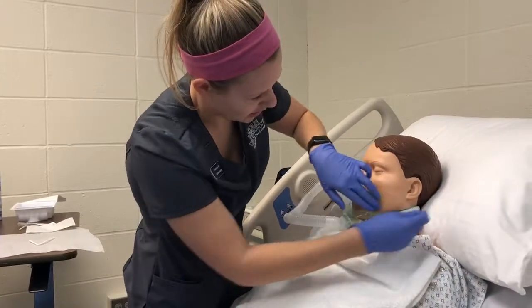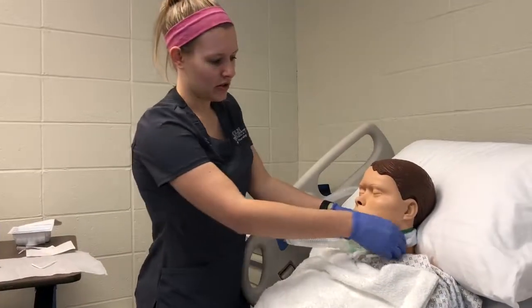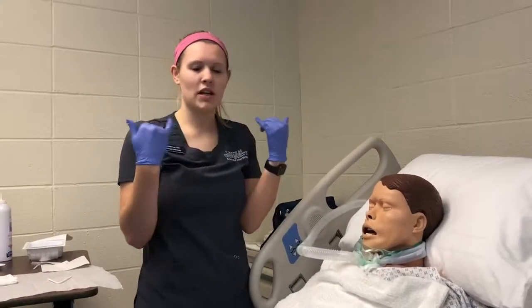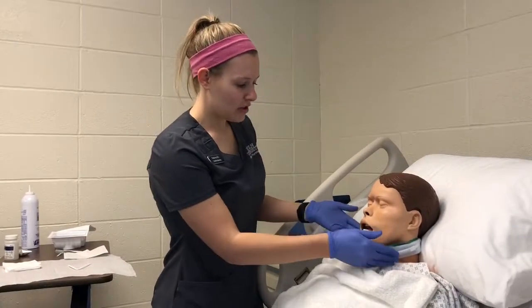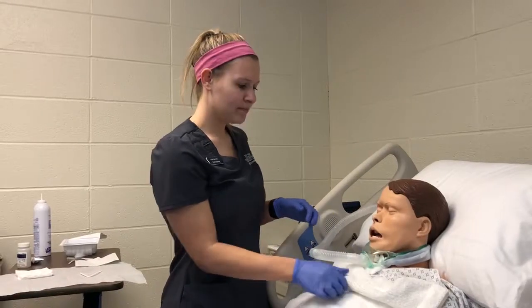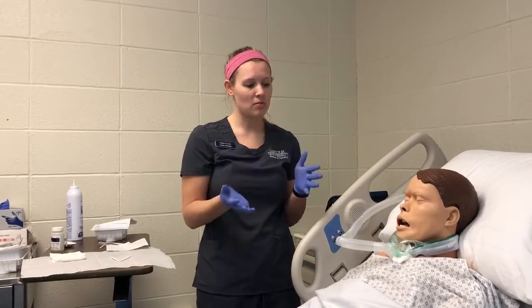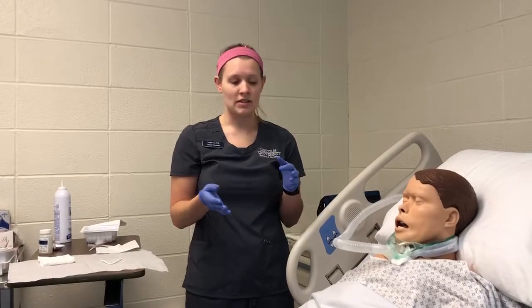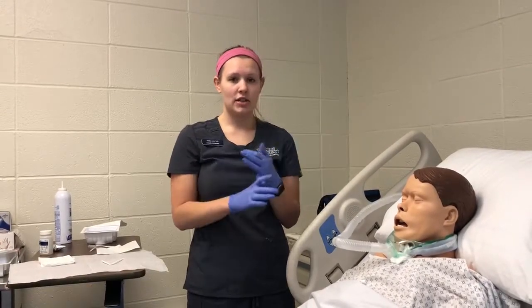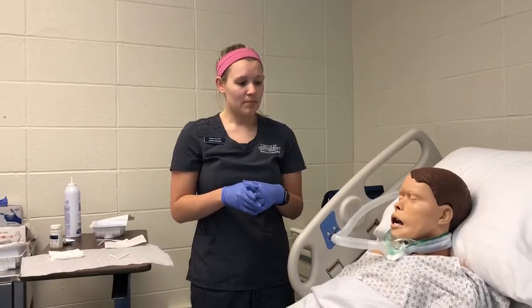Okay, and then you can just adjust it to your patient's, and you would do the same on the other side, just making sure that there's room to move and it's not too tight and you're not causing any type of skin breakdown. So the patient's getting oxygen again, the trach ties are changed, they have a new dressing. The procedure went well. The patient didn't use the thumbs up, so they were comfortable. And then the last thing that I would do is I would need to document all of this to make sure that it's in the chart that we did trach care, we did suctioning, and that we're providing the correct care for our patient. And that is all.